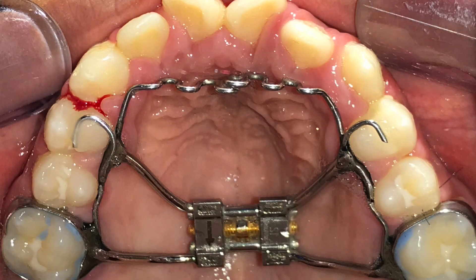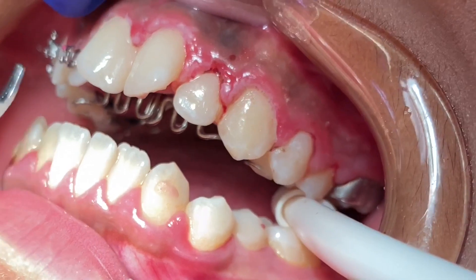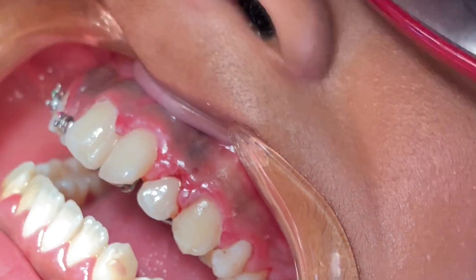What we did was make him an expander — a little appliance — and then we put what we call a tongue crib on there. Basically, we locked the tongue down into jail so it's unable to go in between the teeth.